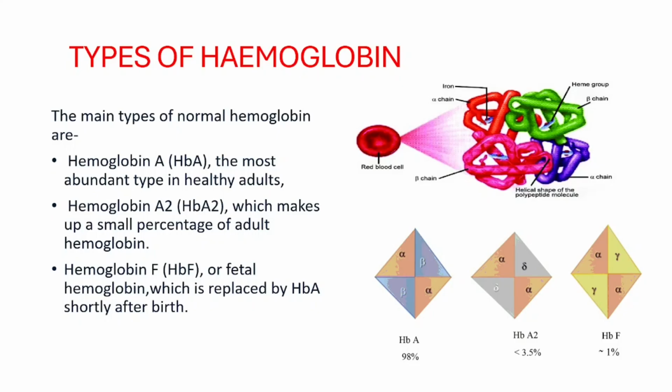Then what will we do as the next step? We will go to Hb electrophoresis to find out the underlying reasons for this anemia. What happens when we put blood in an electric field? Just imagine. Do they run together or do they stay still or what? Okay, they run at different speeds. Even abnormal hemoglobin takes unique positions, and doctors compare these bands and tell which type of hemoglobin is present.